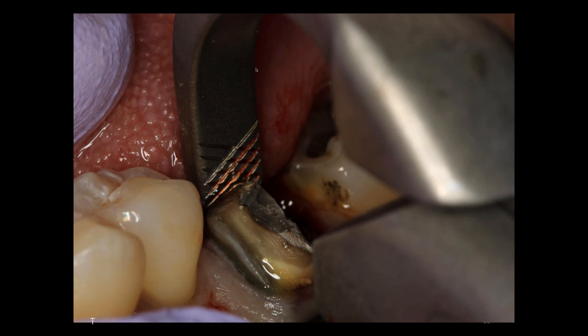That root will come up and out of the socket, and I will have a nice four-walled socket to deal with.